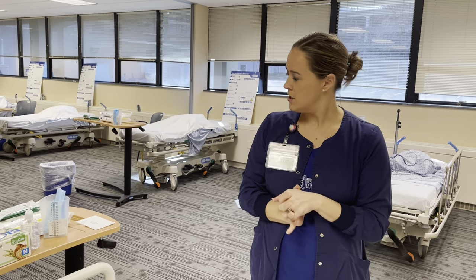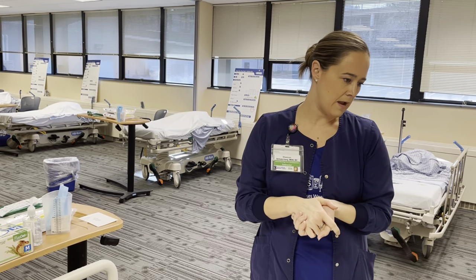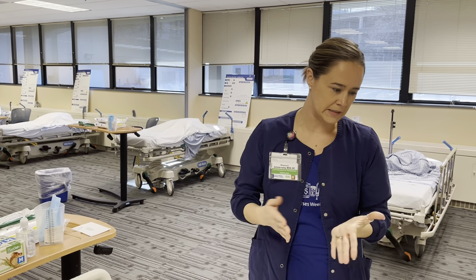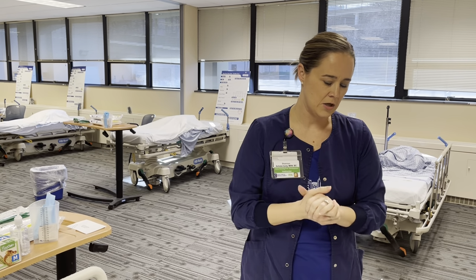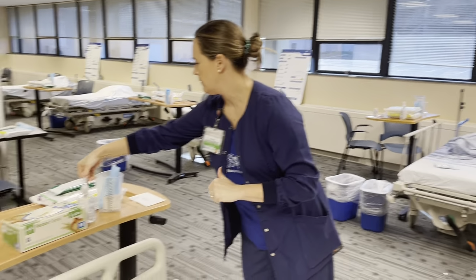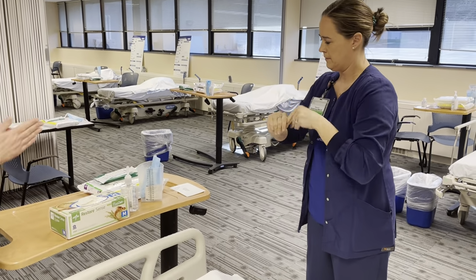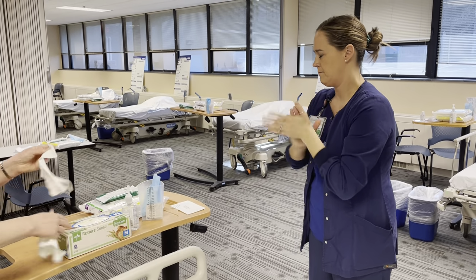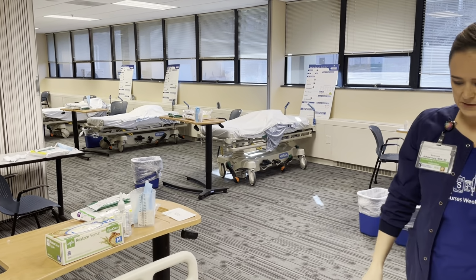Okay, excellent. So Janine and I are going to be setting up the area. We're going to first start by cleaning you. It's very important that you're as clean as possible before we begin the procedure. So we have special wipes that we're going to clean your area with. Is that okay? Yep. Okay. Close the curtain for privacy. And I am going to raise your bed up, sir.